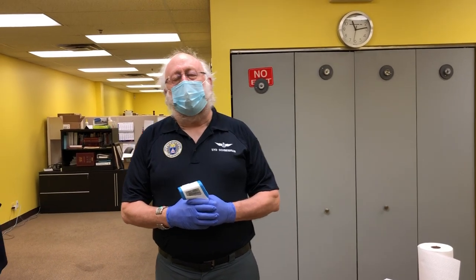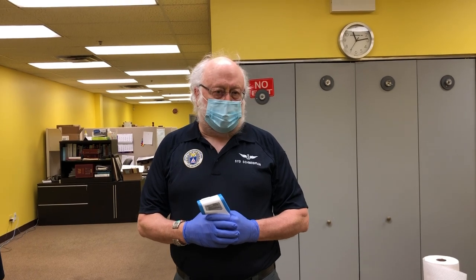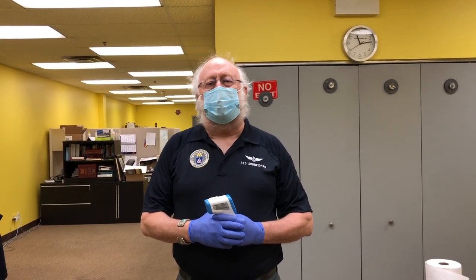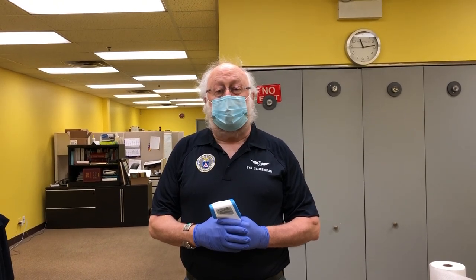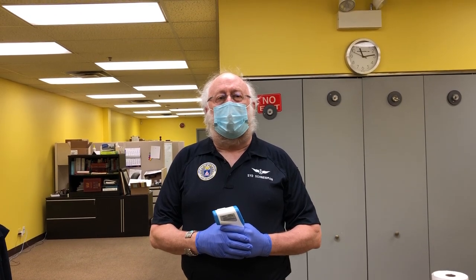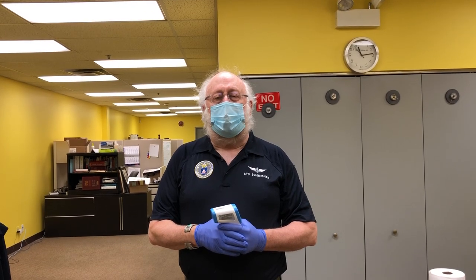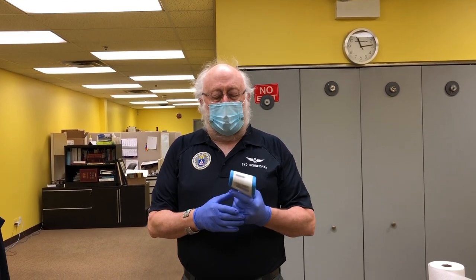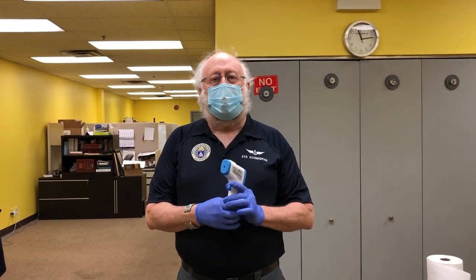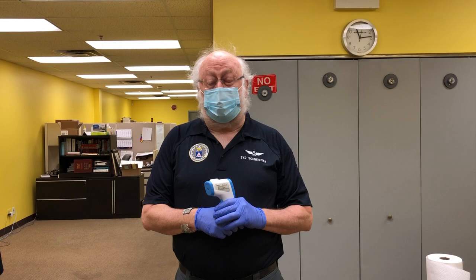Good afternoon. I'm Lieutenant Colonel Sidney Schneidman. I'm the Illinois Wing Medical Officer and we are making every effort to begin the opening of the Illinois Wing for member meetings. In order to do that, we have a procedure that we'd like you to follow when you have your meetings. It involves a temperature check and a screening with screening questions that I'll demonstrate in a few seconds.